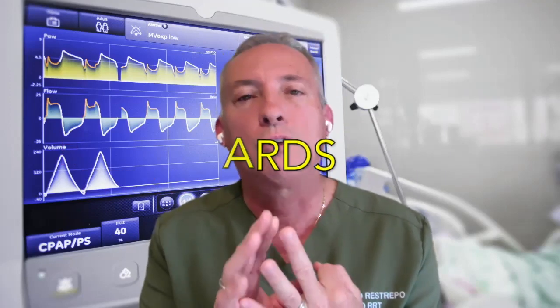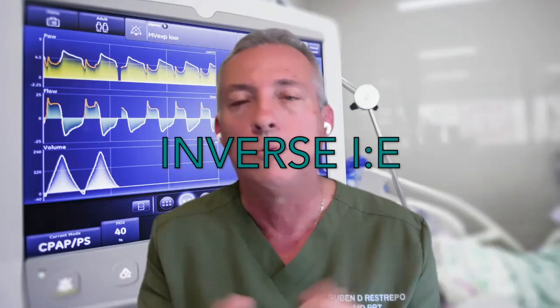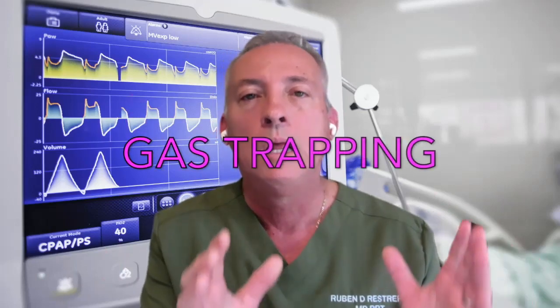The second thing that you have to keep in mind is that when you get to the ventilator, you need to be thinking that I need to see inverse I:E ratio. While it varies, it could be typically between 3:1, 4:1 to start with. And the other aspect that you need to have in mind is that you need to be able to generate something that you hate seeing in different modes, which is gas trapping.